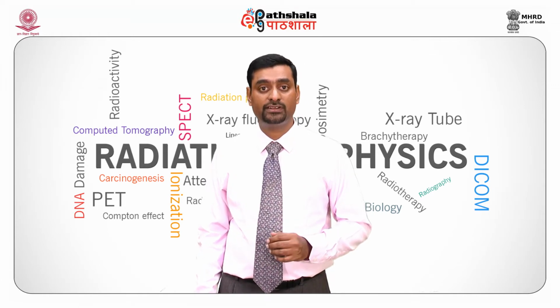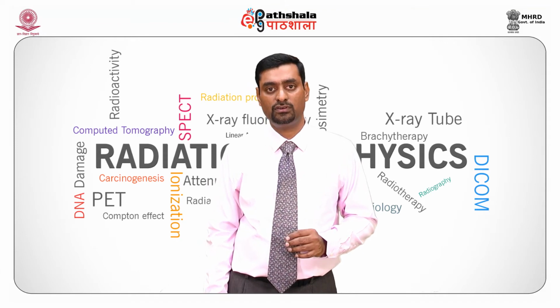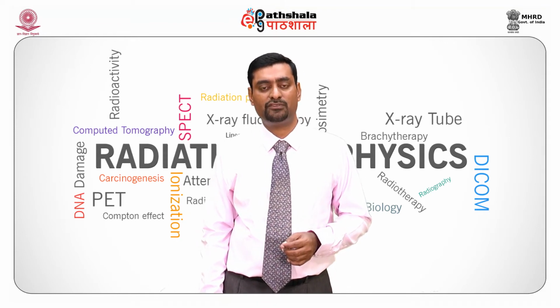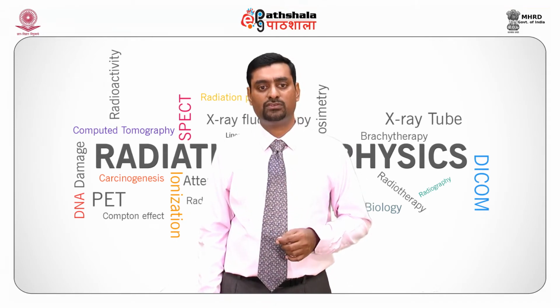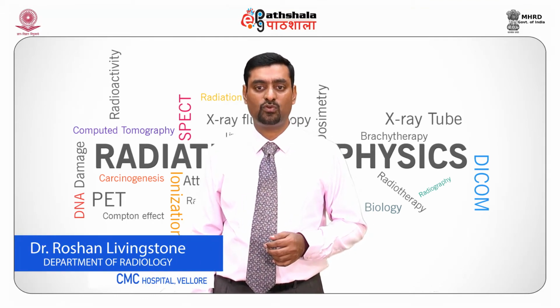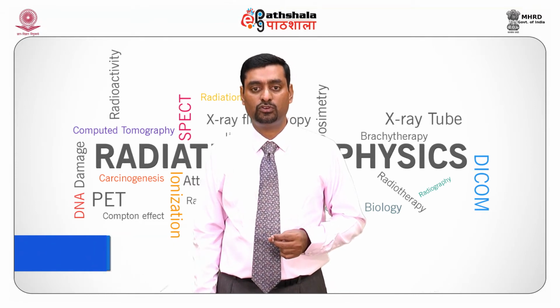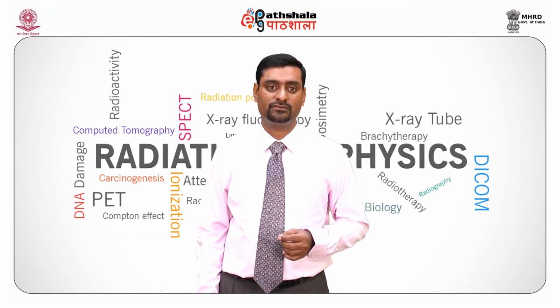On top of that, we also put the supercoat, a protective substance made from acetate. It helps to resist surface abrasion and includes antistatic qualities. It is transparent and water resistant to protect the sensitive phosphor crystals.